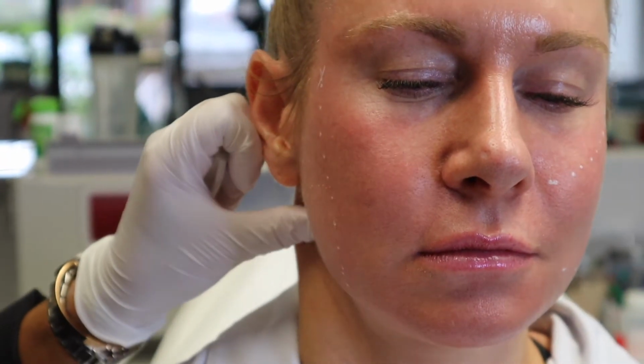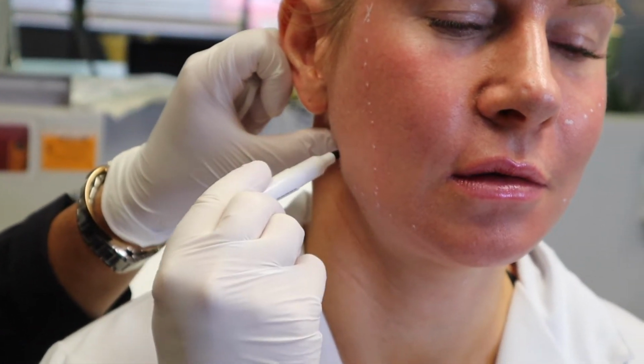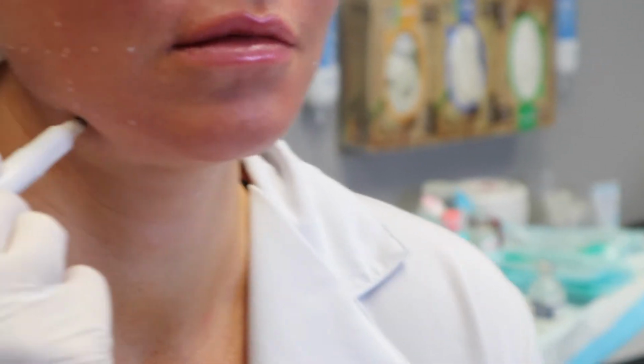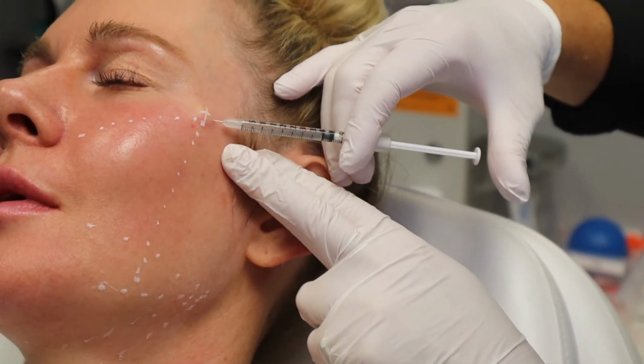The thing about PDO threads, which is really awesome, is that we can see an immediate mechanical lift of about 3 to 5 millimeters in the face. And then over time, the collagen that develops will continue and increase and just give this wonderful, very long-lasting effect.